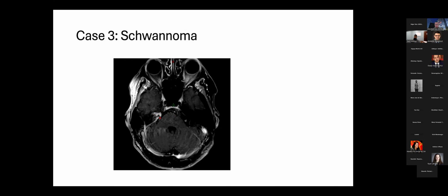So after her original audiogram, she had a 1-year follow-up MRI, and there was about 1 millimeter of growth in this direction, in the transverse direction, and about a millimeter of growth in the Z direction, which I'm not showing here. So this patient's tumor grew. Her hearing was already not really serviceable, so we weren't necessarily hoping to preserve her hearing, but we wanted to prevent further growth. Okay, and this is how the tumor looked on T1 contrast MP-RAGE imaging.